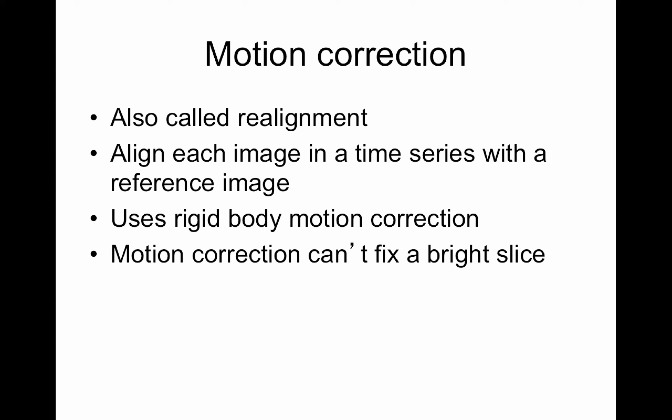Motion correction is not something that can be skipped. It's run using the McFlirt algorithm. I used to run it before my FEAT analysis but now I run it within the FEAT analysis, because previously I didn't have an option to add the extended motion parameters. This is also called realignment — you align each image in a time series with a reference image. This refers to the raw BOLD time series, not registering things to MNI space — that's later. Everything about the level one analysis is done in scanner space.